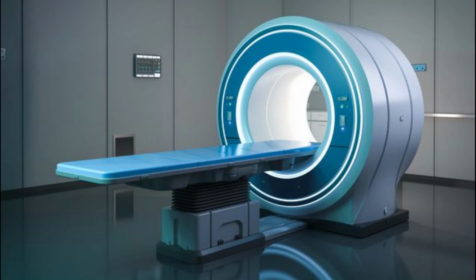MRI is, in general, a safe technique, although injuries may occur as a result of failed safety procedures or human error. Contraindications to MRI include most cochlear implants and cardiac pacemakers, shrapnel, and metallic foreign bodies in the eyes. Magnetic resonance imaging in pregnancy appears to be safe, at least during the second and third trimesters if done without contrast agents. Since MRI does not use any ionizing radiation, its use is generally favored in preference to CT when either modality could yield the same information.